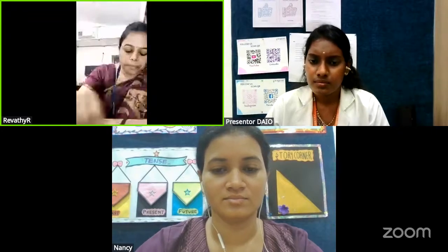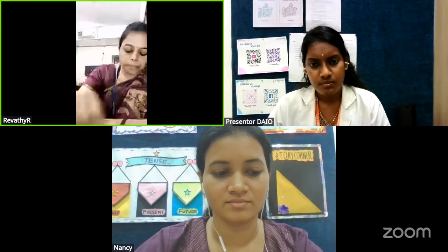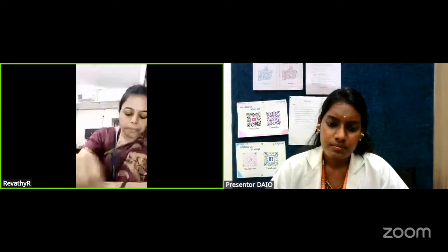Where else will you be performing keratometry? In pre and post refractive surgery patients, in addition to the regular OPD patients where you see astigmatism. In all pre and post LASIK or any other refractive surgeries, we need to document K. And if there is a post-corneal transplant, or if you are monitoring keratoconus progression or PMD's progression, you need to document the cornea's curvature at every visit to see how much it has changed since the last visit.